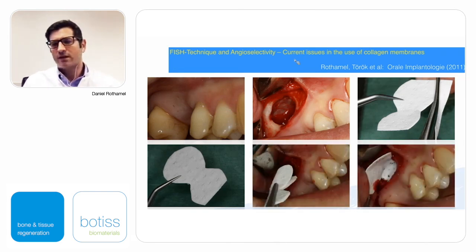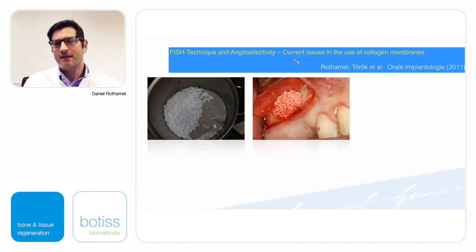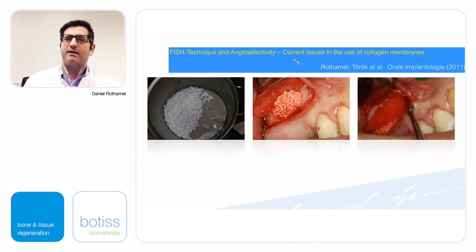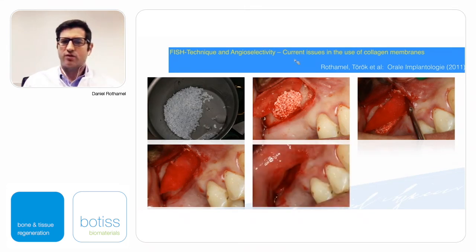The fish is folded, the head is installed into the sinus cavity, and then the bone substitute material is applied underneath. And we know that we also get a little better results when we apply a membrane on the buccal aspect, so we can just, after rehydration, fold the tail of the fish over the grafted area, soft tissue closure.